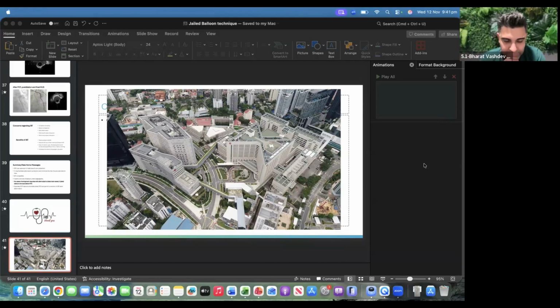As we just underlined, this is an advanced technique for dealing with bifurcation, with some potential advantages as compared to just a protection with a wire. And I think that from this lesson and the discussion and interaction and the cases that you presented, we all came out with some new expertise and a willingness to try this technique in some important bifurcation with an important side branch that we don't want to lose.